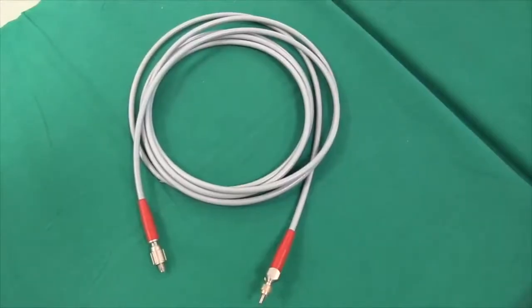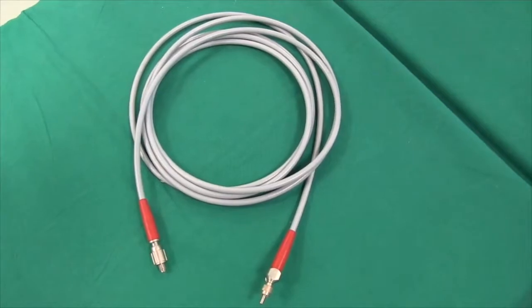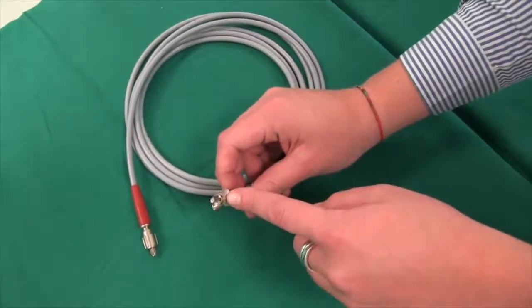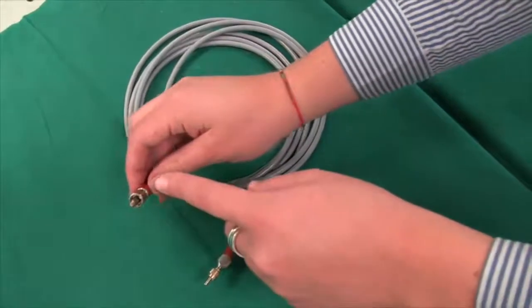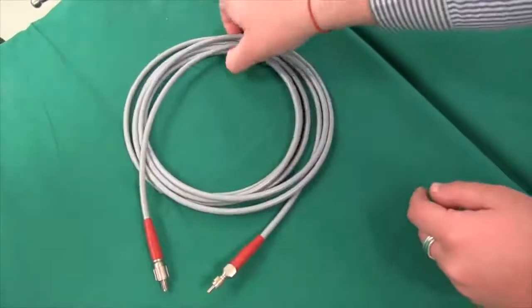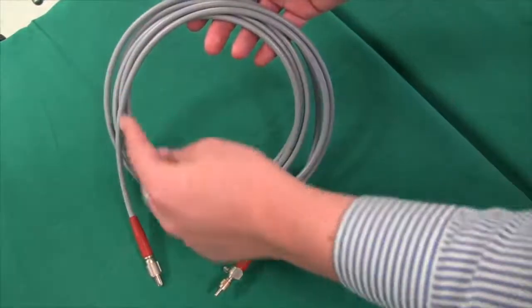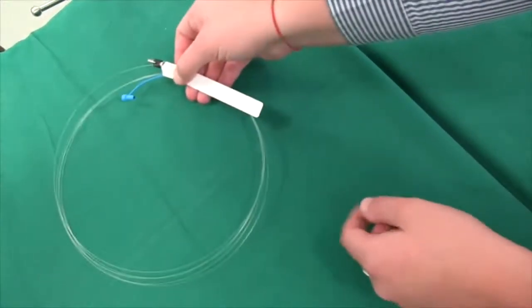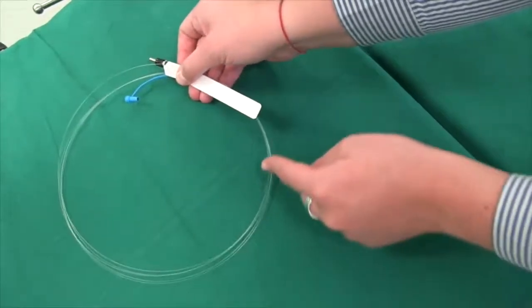While the laser boots, you can check visually if both ends of the supply fiber are clean and not showing scratch marks. Please also check if the entire length of the supply fiber or the bare fiber is in undamaged condition.